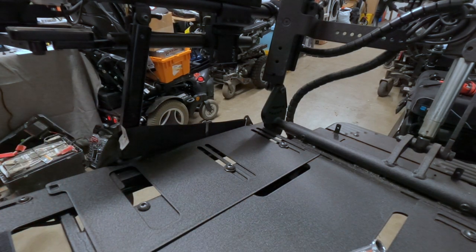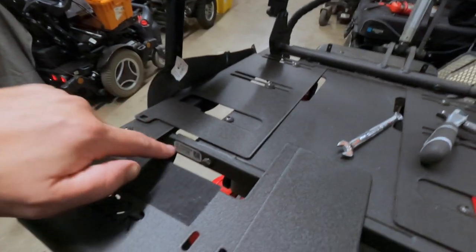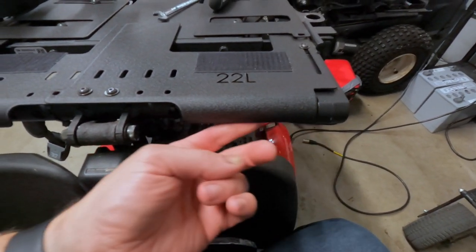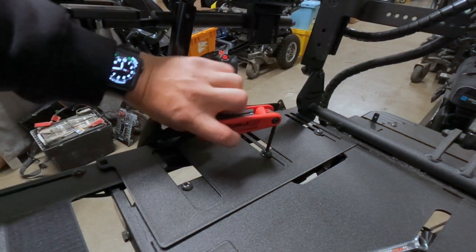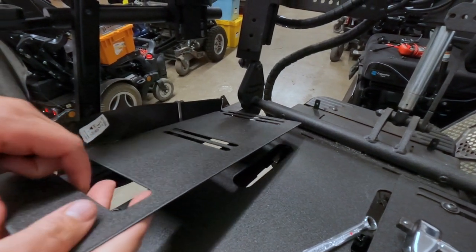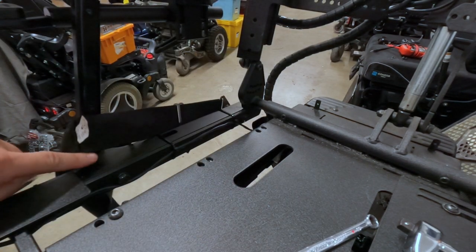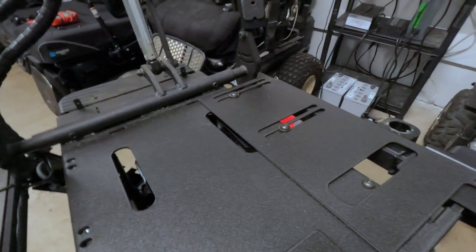Motion Concepts does have a video about this from about seven years ago that's fairly detailed — I kind of skimmed through it. I think we have to pull these off and then there's some screws here in the front that attach to the side rail, and maybe up here as well. Just looking at it one step at a time. This appears to be just a cover plate — it's not really structural. In theory I could have left it on there, but I want to be able to access everything down here.